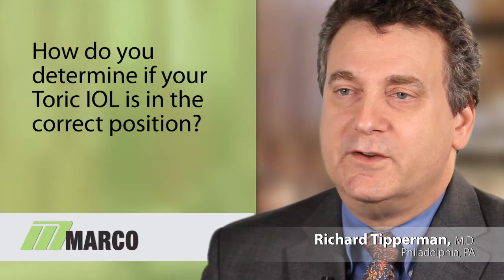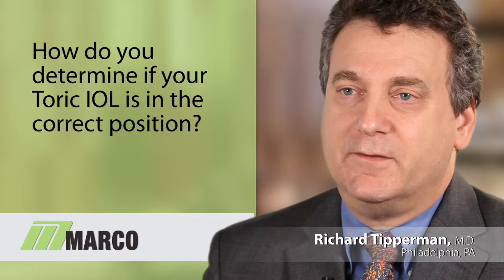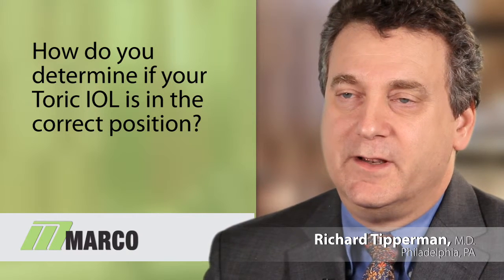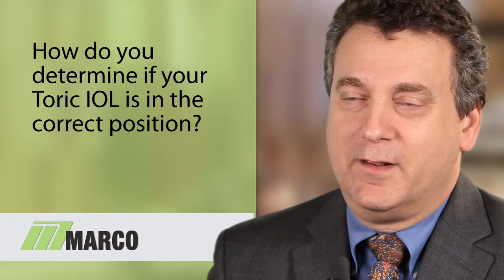Often at courses, physicians will always ask, how do you determine if your toric implant is in the right position following cataract surgery, or if it's shifted? To some degree, pragmatically, if the patient is seeing well and doing well, it may not be academic, but I'm less concerned about the position of the toric implant.